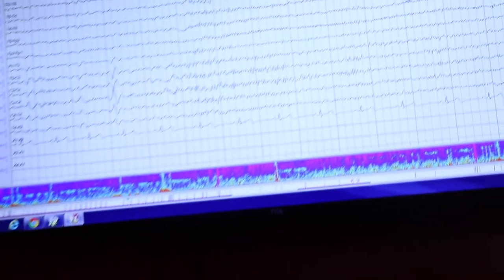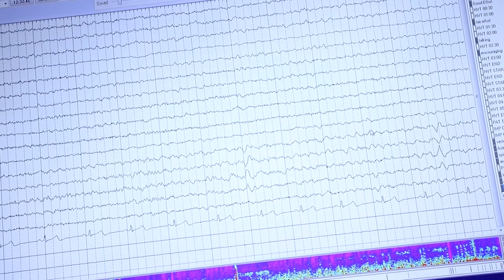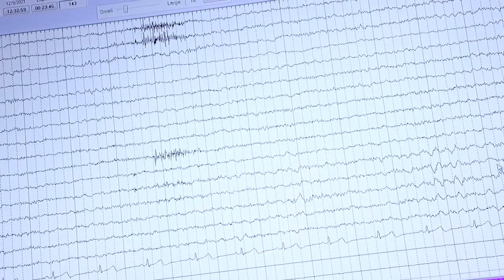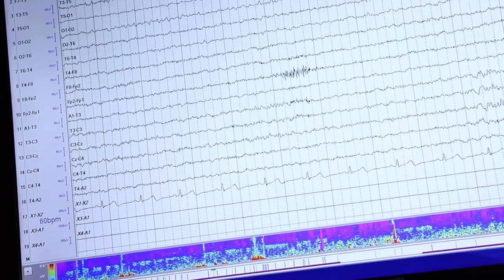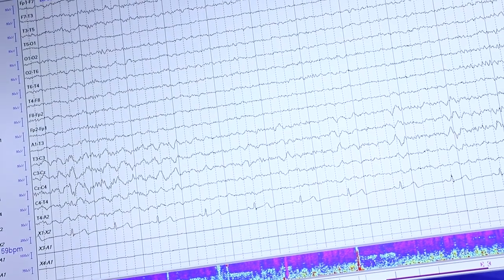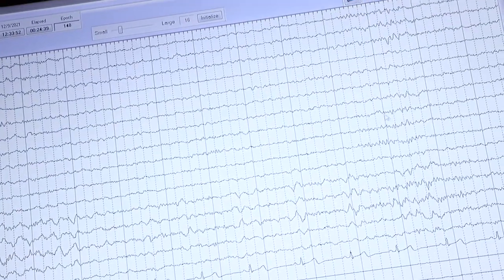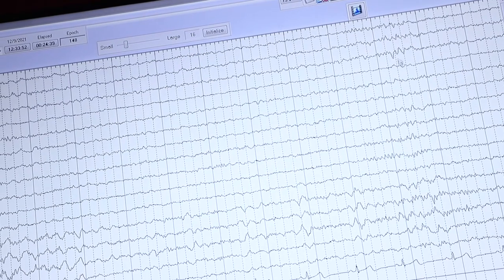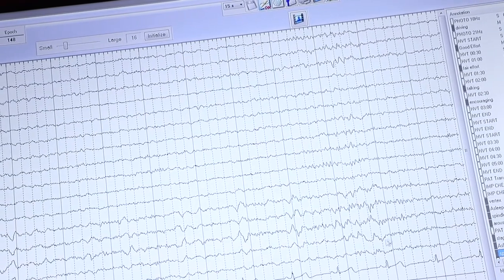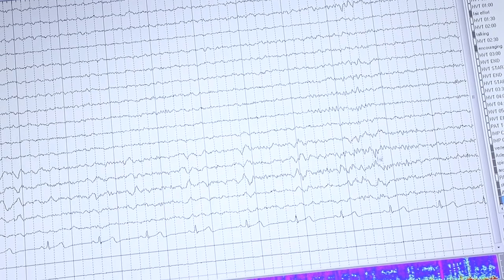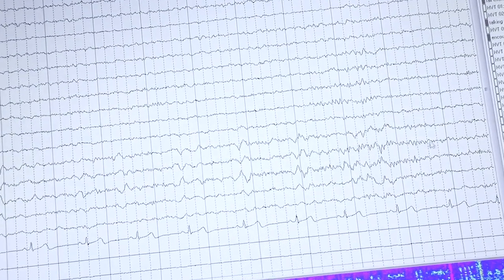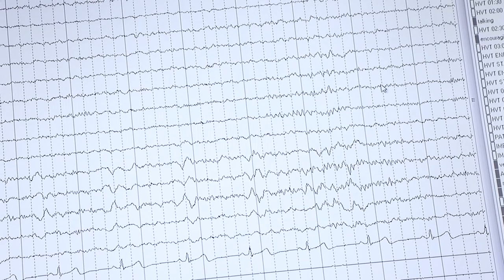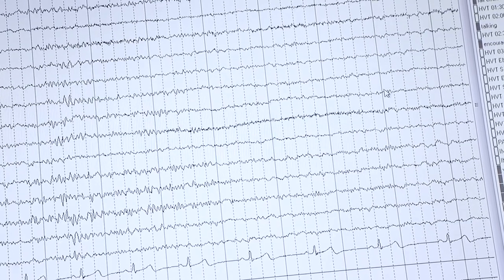There's another marker that I don't have here, but there are several more vertex waves as I keep moving down. There are K complexes, and this may be one of them — it's very busy, with all channels involved. There's a K complex, vertex waves, and a bunch of spindles around it. So that's again a marker of Stage 2.